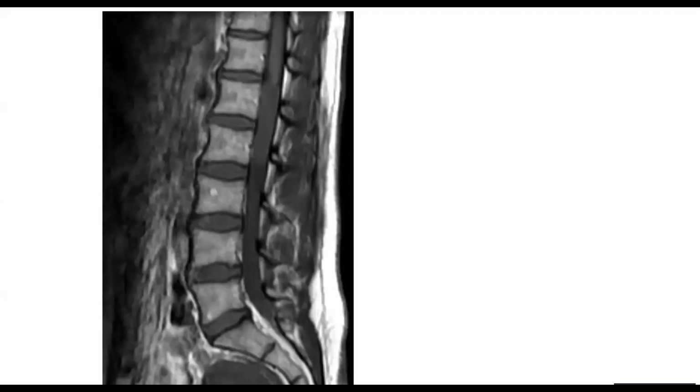So again, have a look at this. Can everyone see right here? Here goes the conus coming down here. This is where the filum starts, and look at this big oblong mass. Everyone see it now? Yeah. Now, because it's not showing up, because of T1, it's inapparent. But that is the eye for detail.